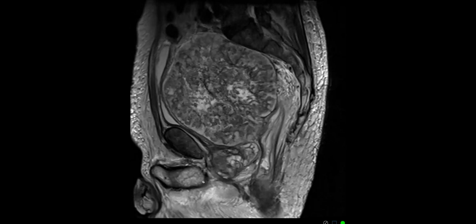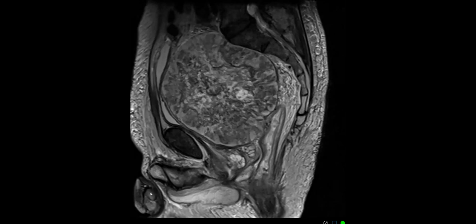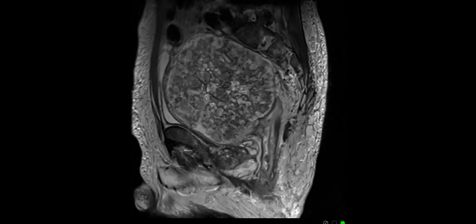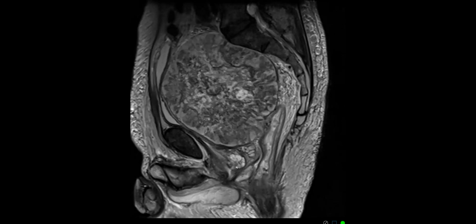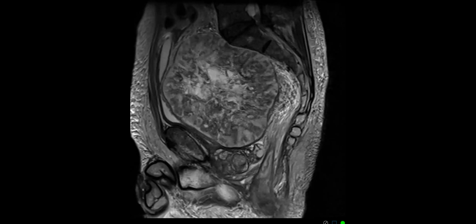You cannot trick Aarti. And you have to explain the polypoid lesion from the anterior part. Here also you can see the penis as well, and here we can see the prostate. So this is an 82-year-old male, and the patient had a borderline PSA, so that's why the patient was sent for prostate MRI. And I would say this is a coincidental finding.